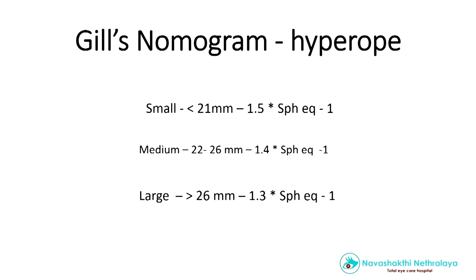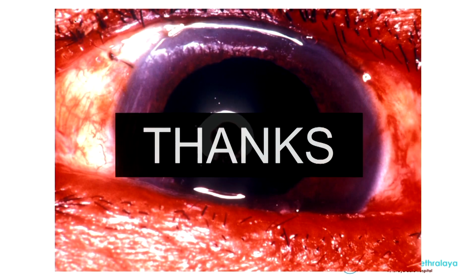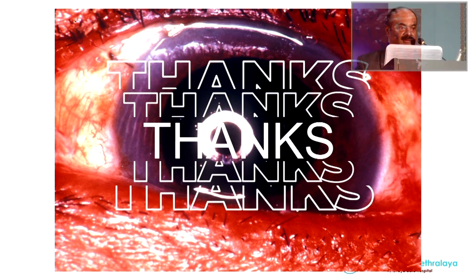If you look at that 5 diopter error which I had, all three formulas come within a gap of around 0.5 to 0.75, a 0.5 to 0.6 dioptric difference. So we can use any one of these to calculate the lens and place it in the eye. Once again, I thank KSOS, Dr. Arup Chakravarti sir, and Shini for the opportunity. Thank you.